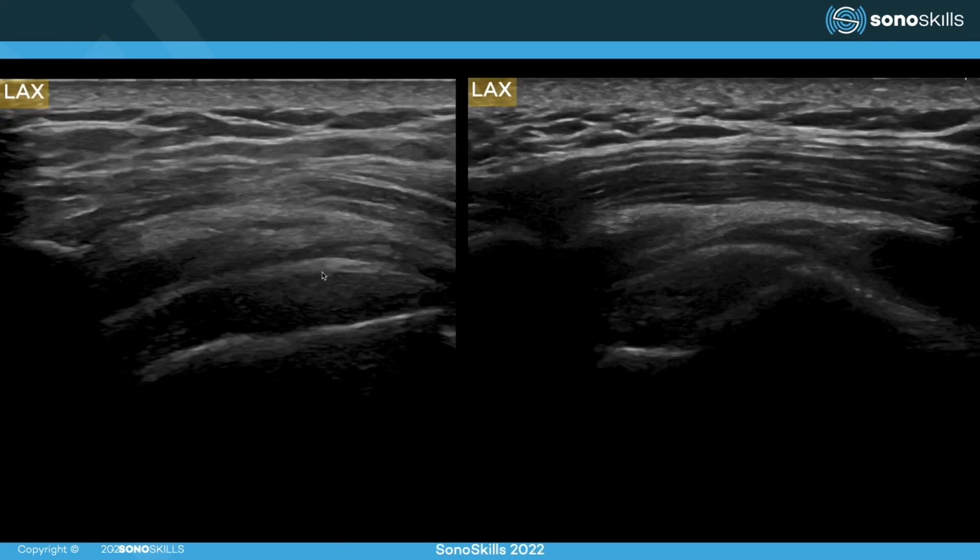Here we can see also a bursa. We can see that the whole complex of tendon and bursa is thickened and does not fit into the subacromial space. And on the right side, you can see that during the abduction, the bursal fluid is also being pushed outside to lateral because it follows the pathway of least resistance. And then you might see a collection of fluid effusion in the bursa while making this abduction.